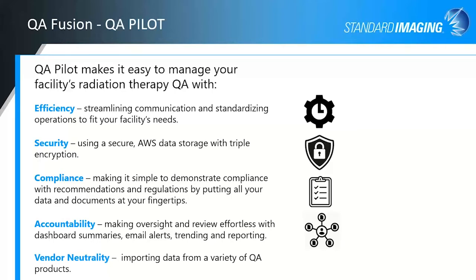And we also really help the physics community by being vendor neutral. And when I say that, I don't mean that we're just LINAC manufacturer vendor neutral. I mean that although it is my heart's desire that you get the best QA tools to do your jobs, and that would mean standard imaging, we fully recognize that you probably have a variety of devices in your department. And we also support a variety of QA devices other than standard imaging within QA Pilot.